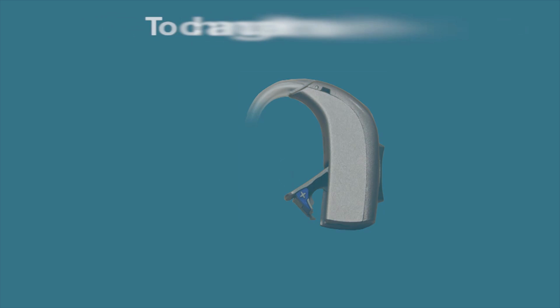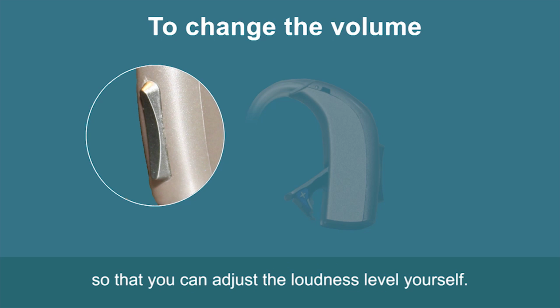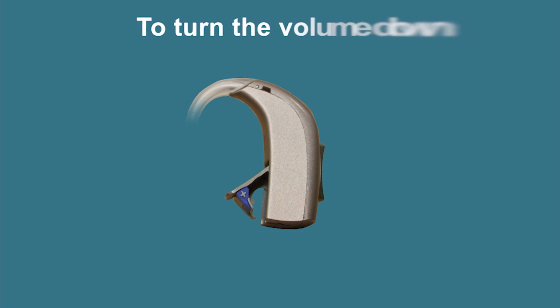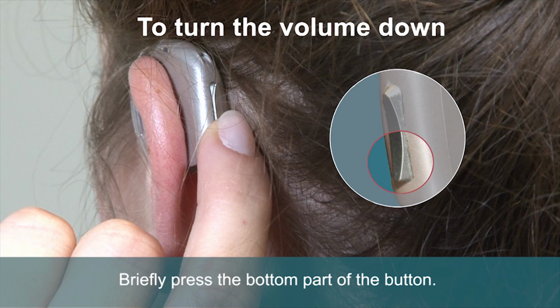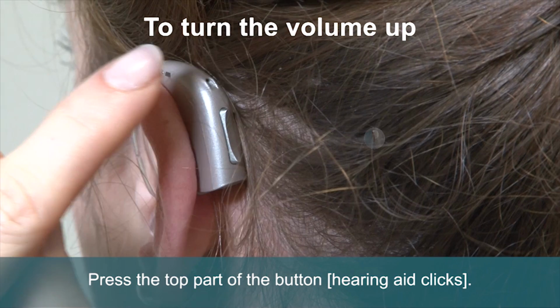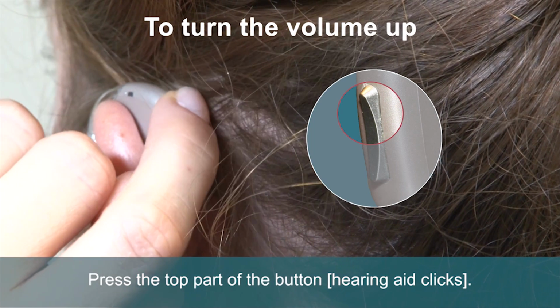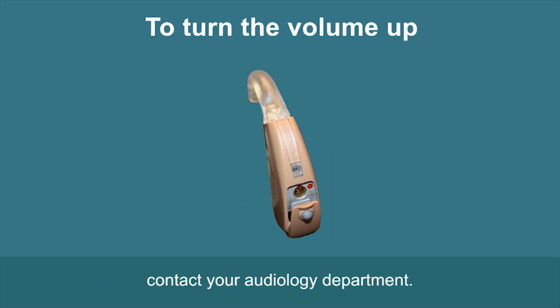To change the volume. Sometimes, but not always, the audiologist may program the volume control so that you can adjust the loudness level yourself. To turn the volume down, briefly press the bottom part of the button. To turn the volume up, press the top part of the button. If your hearing aid does not have a volume control available and you feel that you would benefit from one, contact your audiology department.